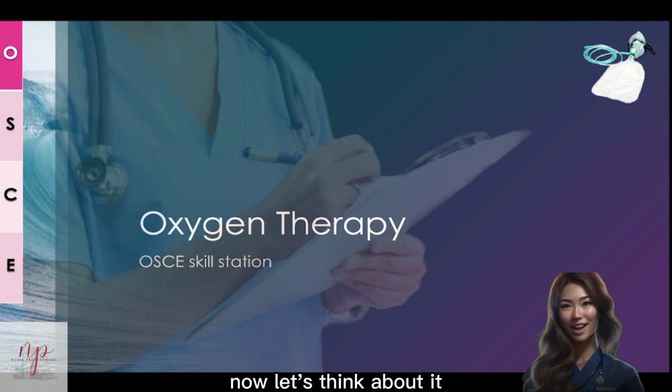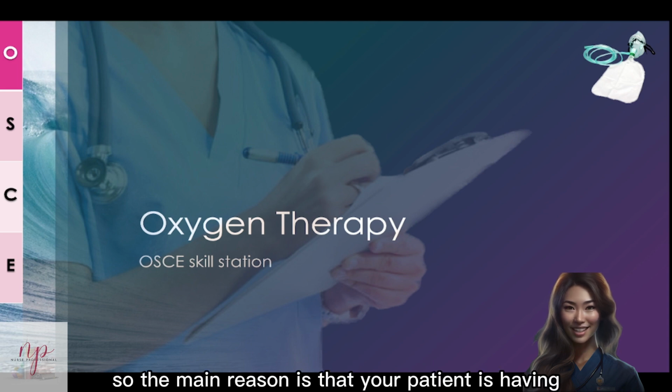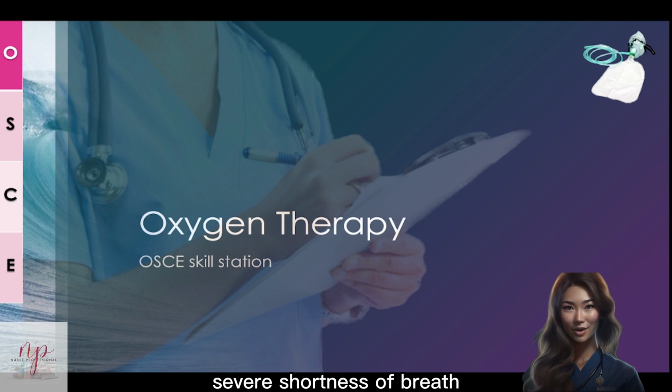But let's think about it. Why do patients need oxygen therapy? Likely it is the reservoir mask. We need to give 10 liters or even 15 liters of oxygen therapy to your patients. So the main reason is that your patient is having severe shortness of breath. Maybe his or her oxygen saturation is below the expected value.